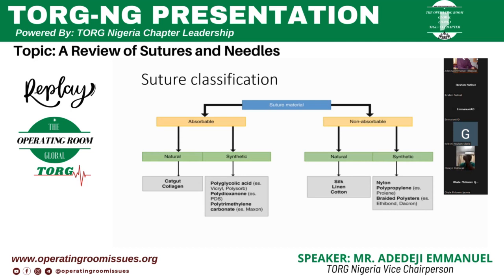But I won't be surprised if we still have some facilities in rural or remote areas where they still use more of the naturally occurring sutures, chiefly plain catgut and chromic catgut.